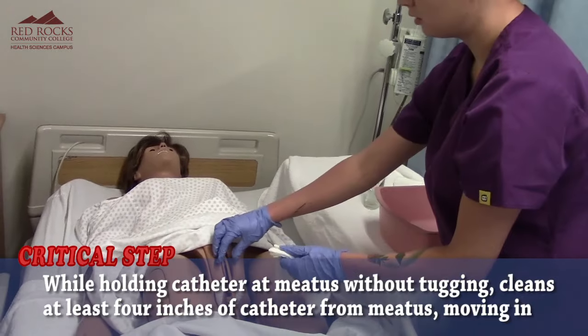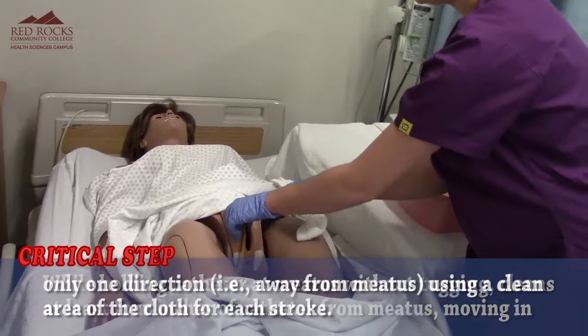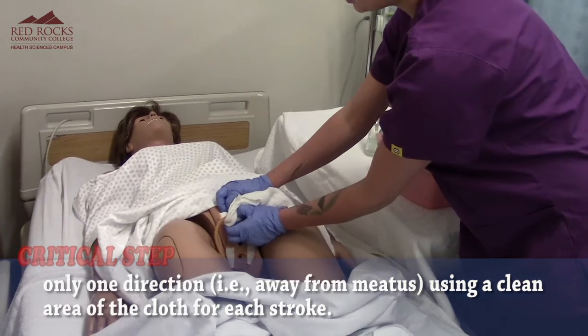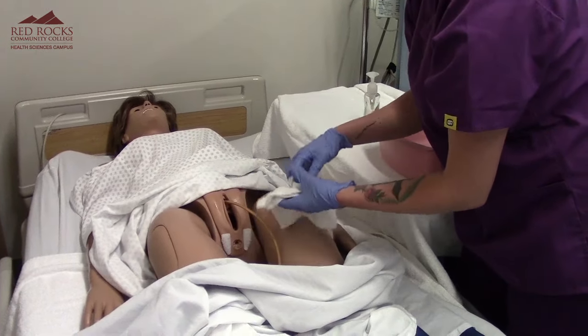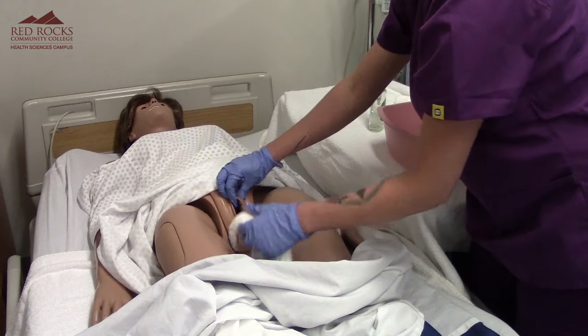I'm going to hold the catheter at the meatus — that's the opening right here — and I'm just going to slide the washcloth down the catheter at least four inches without tugging. I'm going to do that with each of the four corners.